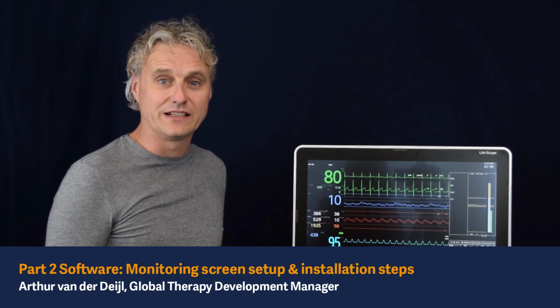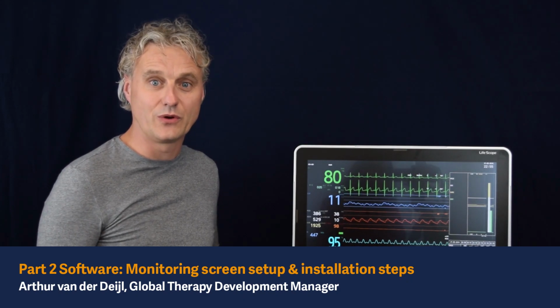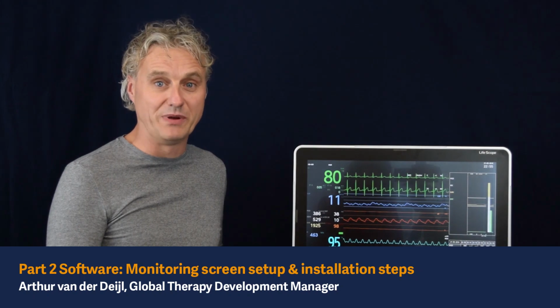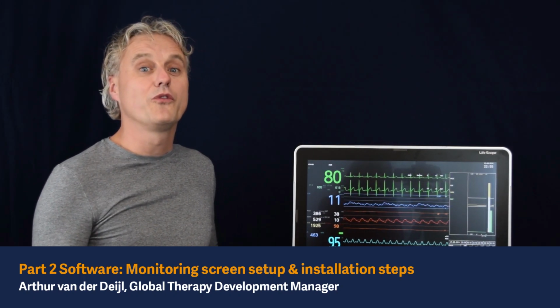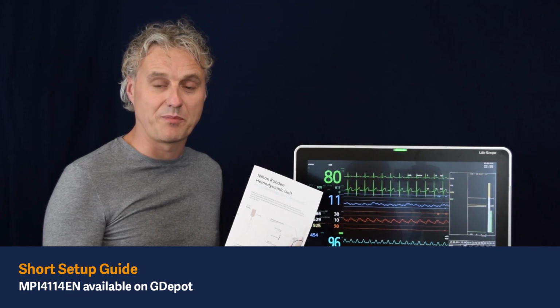After connecting the hemodynamic unit to the main unit, the following instructions will guide you to the monitoring screen. You need to go to the PiCCO screen. All the following steps will be presented in this short setup guide.